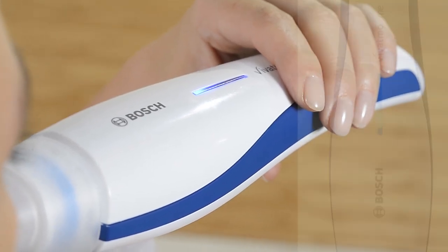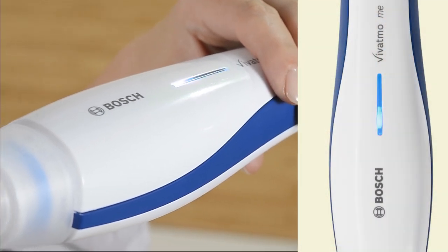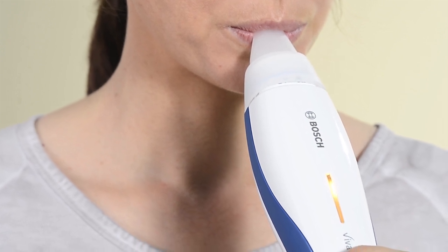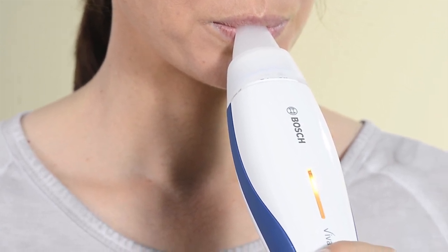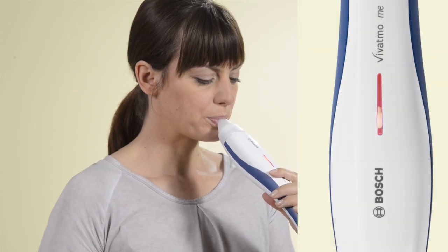If the strength of the exhalation is correct, the LED lights up blue and flashes after the measuring time has elapsed. If the LED lights up yellow as you exhale, you're not blowing hard enough and need to increase the intensity of your breath. If it lights up red, you must blow a little more gently.